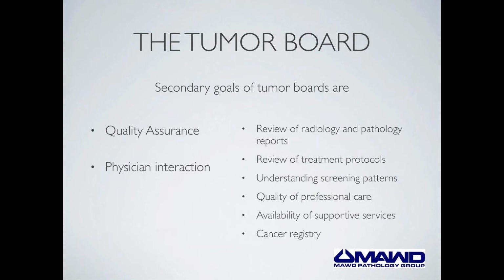Thank you. Now, there are some secondary benefits of tumor boards, the most important of which I believe is quality assurance. See, most cases are presented at tumor boards. They undergo review of their pathology material and radiology images, often by a different pathologist or radiologist, respectively. So this is a professional other than the one who initially signed out a case or reported on the CT scans or X-rays or whatnot. This is a great peer review process, and I think it provides important information on the quality of pathology and radiology services at your institution.